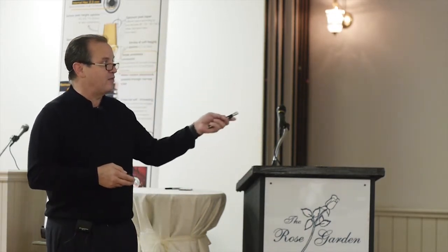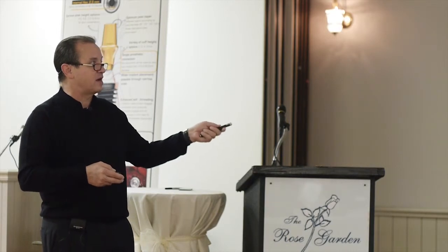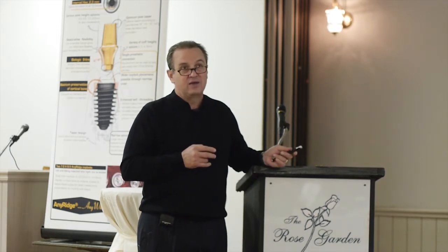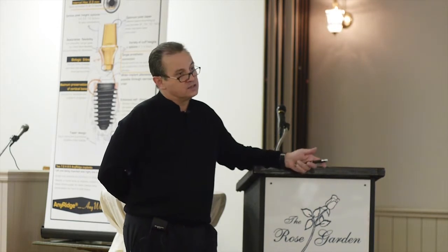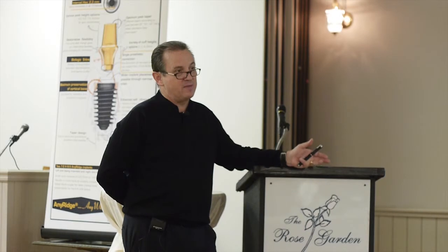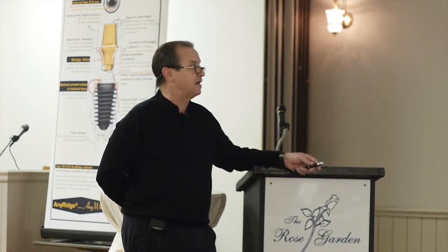And now that we've been doing this, I just don't use stock abutments anymore at all. I find this saves a lot of time. It's a little bit more expensive, not a lot. What does your stock abutment cost? $90. So these are $170. And then I have a temporary made for another $30 or something like that. And we can just take better impressions.